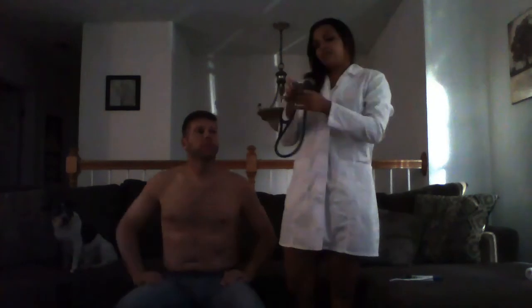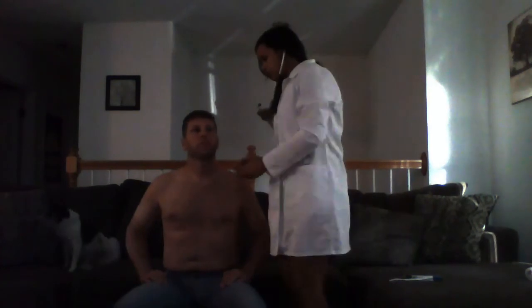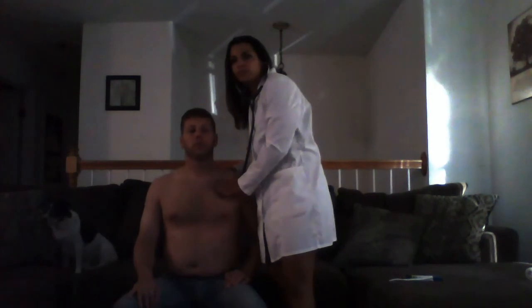Last, we're going to auscultate his lung sounds. Nice deep breath. I also didn't hear any audible wheezing or stridor.